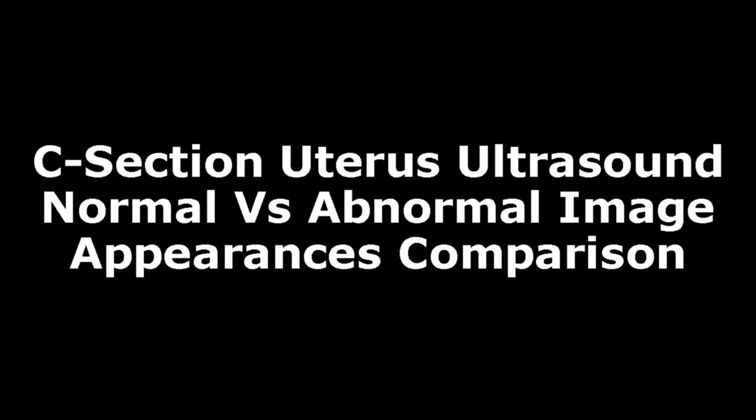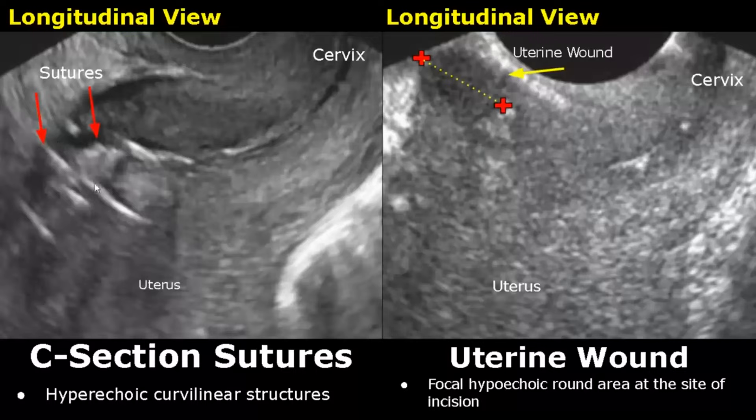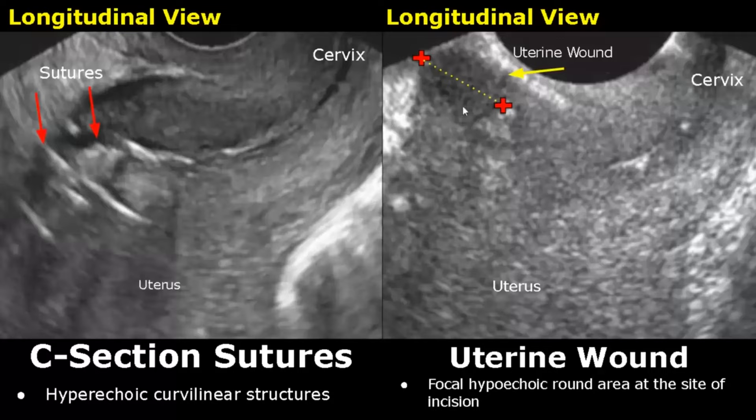Hello everyone, this is Dr. Sam and this video is about C-section uterus ultrasound. These are longitudinal transvaginal images of the uterus after a caesarean section. These curvilinear hyperechoic structures are the sutures, and over here is a uterine wound, appearing as a focal hyperechoic area at the site of the incision.